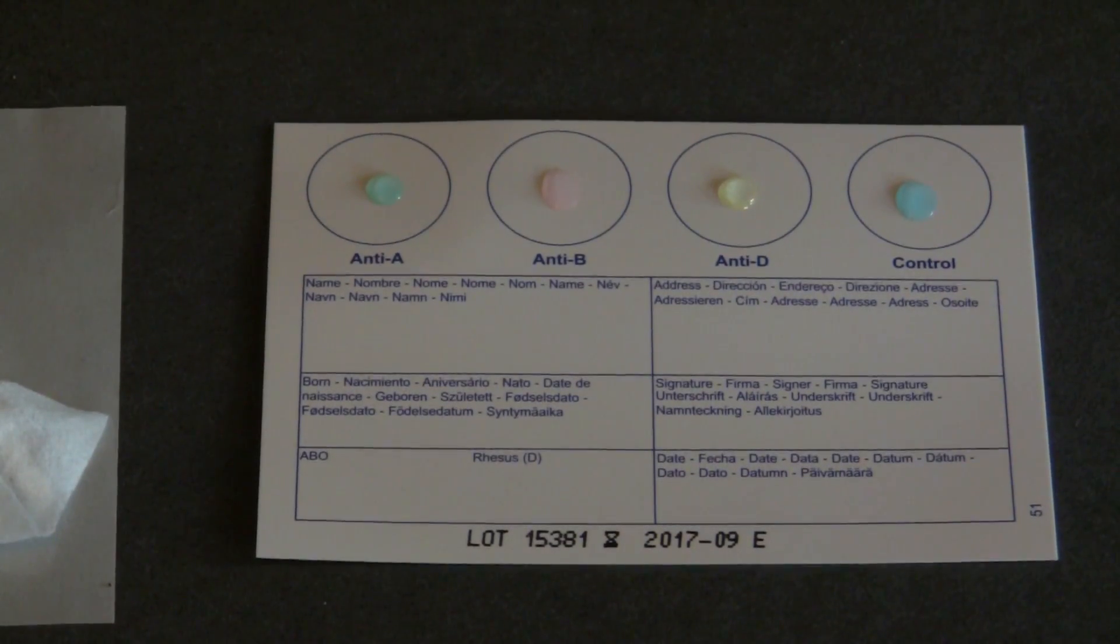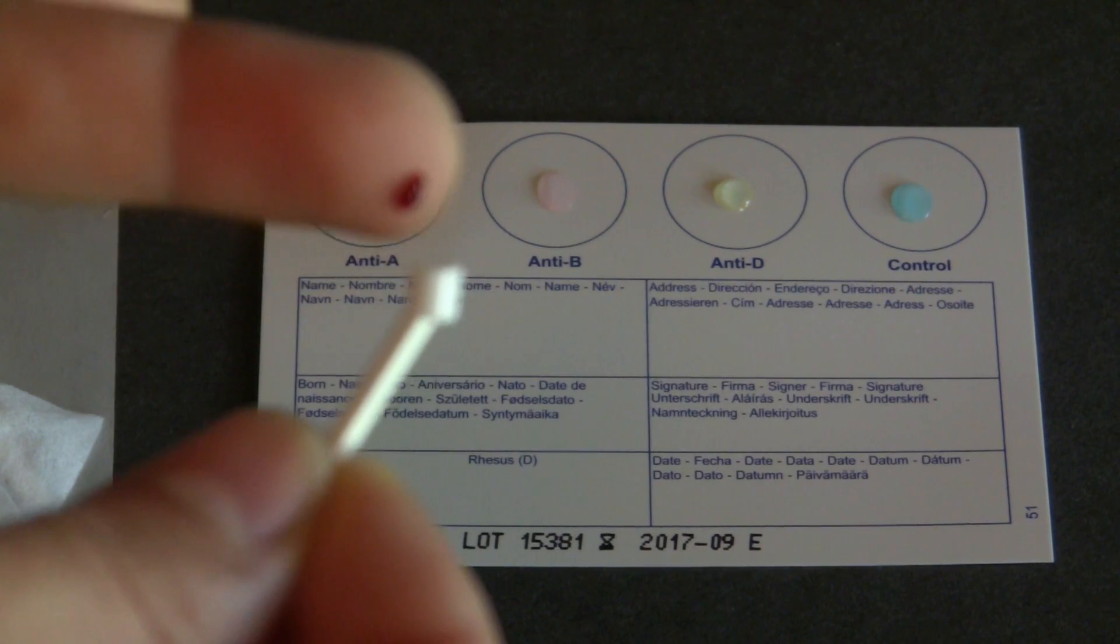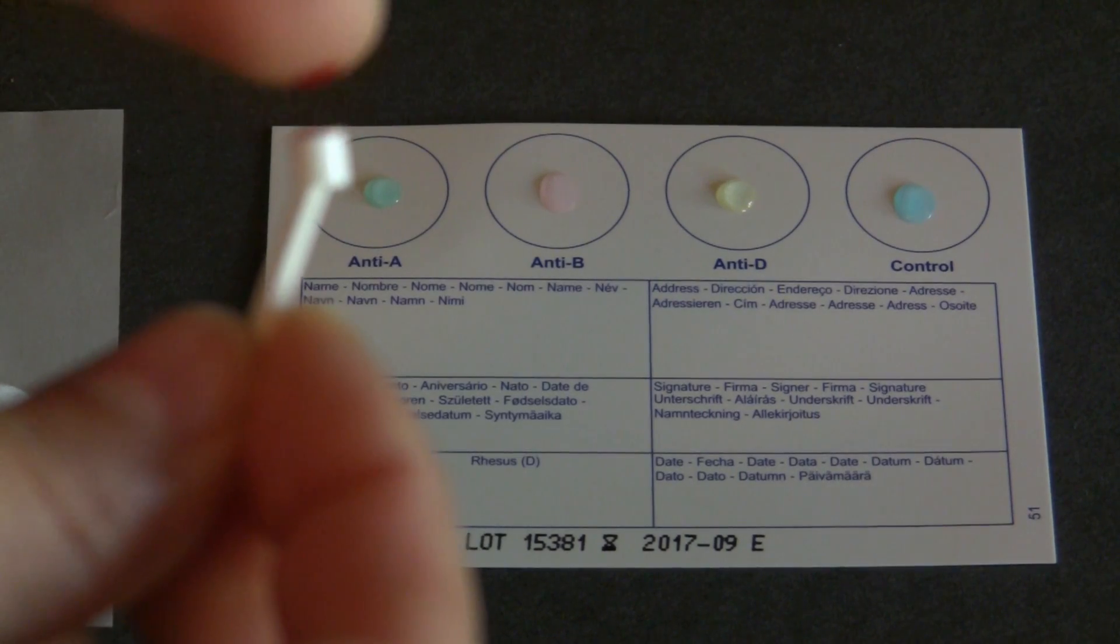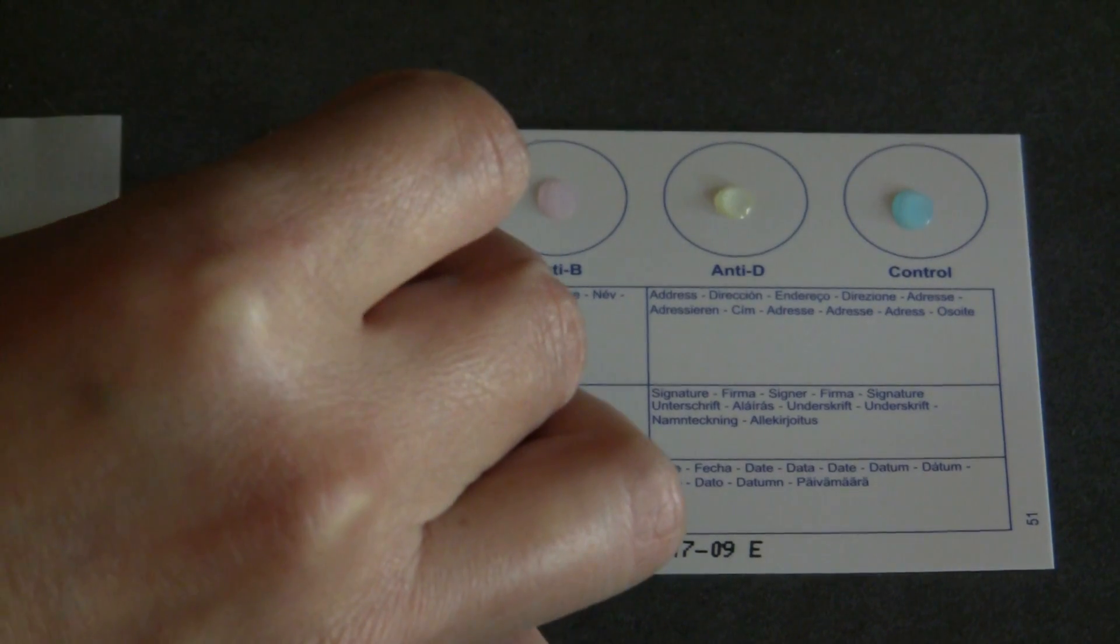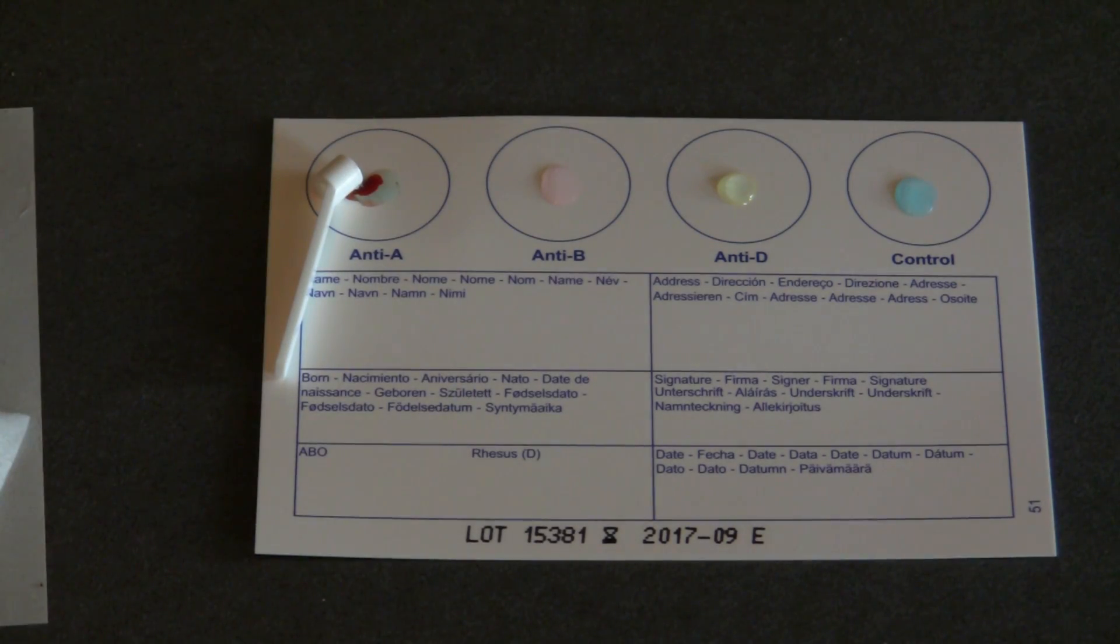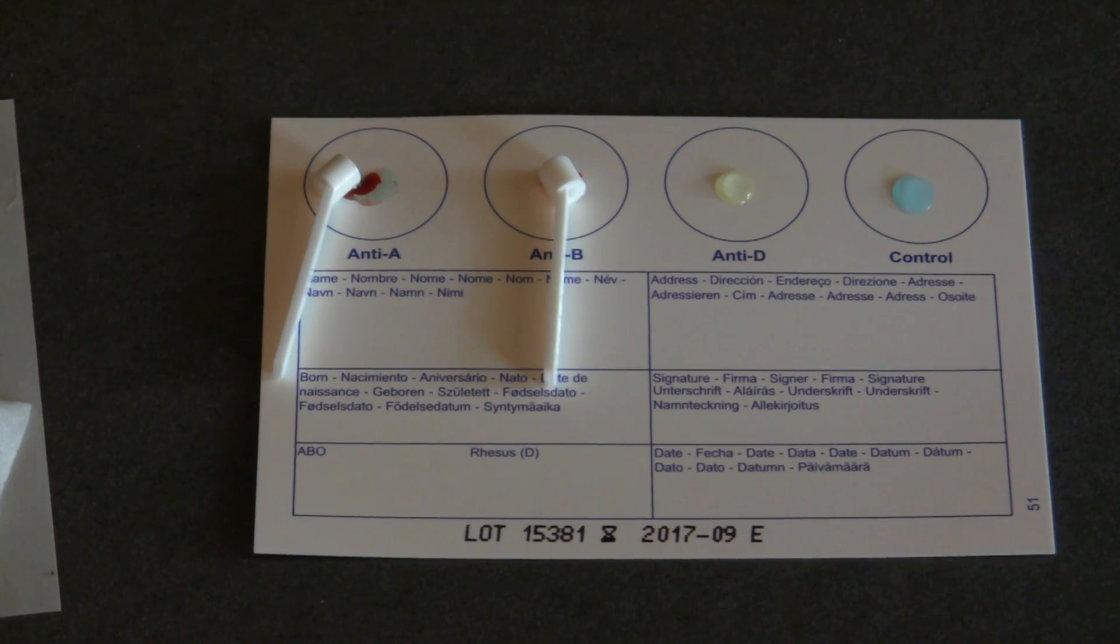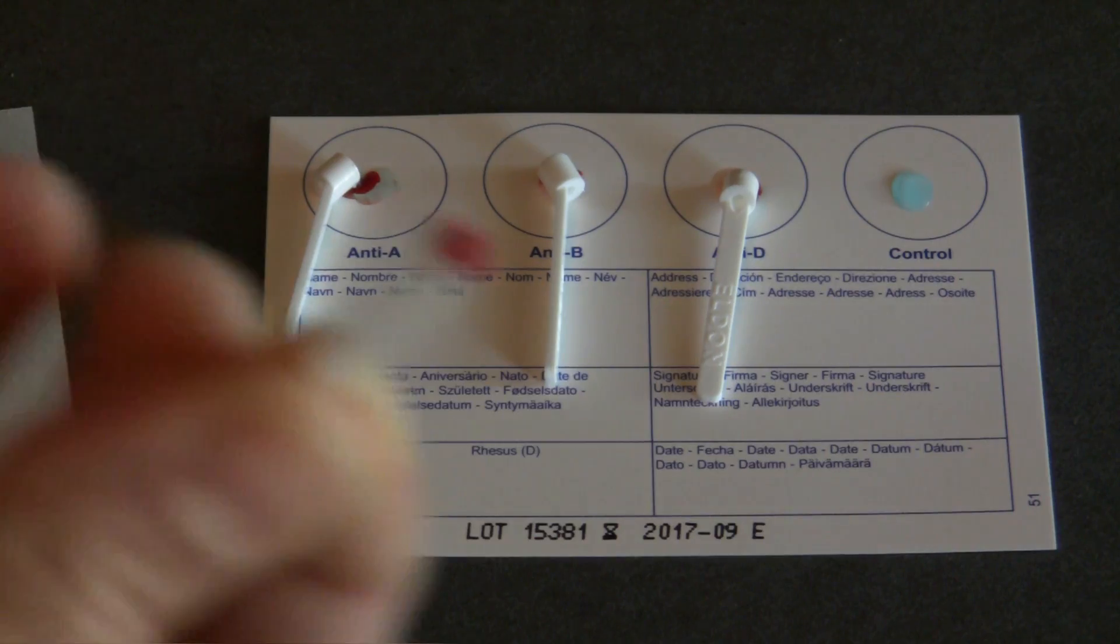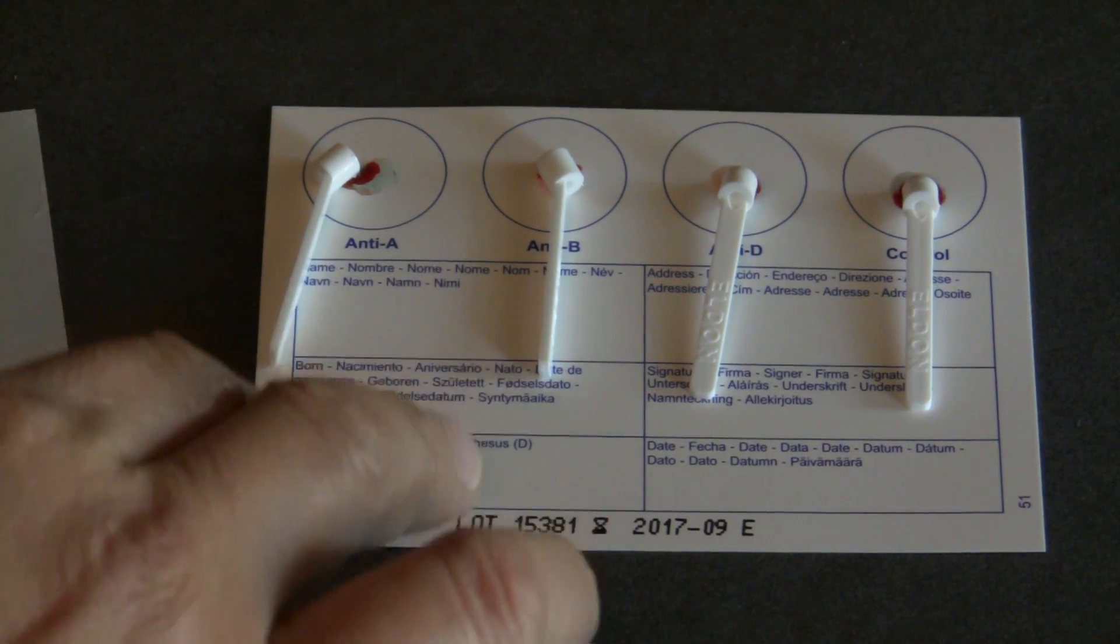There's drop number one. So I'm putting my arm backwards so I can get more blood out. Number two. Number three. I've got blood. Four. Yep, and now we swish it around.